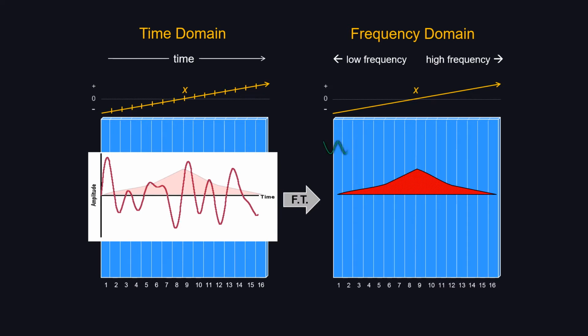So in this case, column 1 will have the lowest frequency. The other end of the echo, you have the highest frequency. Now you can separate the signal based on their differences in frequency. If you see the proton encoded with a low frequency, you know that it must come from column 1. If you detect the proton with the highest frequency, then you know that it's coming from the last column, column 16. So that's encoding the signal based on frequency differences.